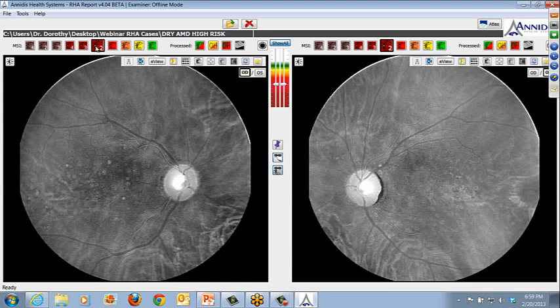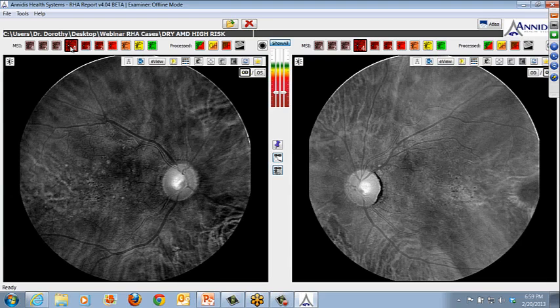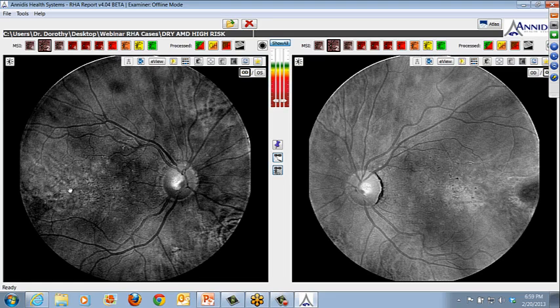As you move into the reds, again, the drusen appearance will start to fade as you get to 3, 4, and you get deeper into the RPE, into the heaviest pigmented areas, and you'll lose some sight of the drusen, and you'll start to pick up areas of RPE atrophy. And again, most hyperreflective in 3 and 4, and will start to fade in the infrared. Okay, but still, again, nicely highlights where that atrophy is. And I like to use these views here to watch for progression.